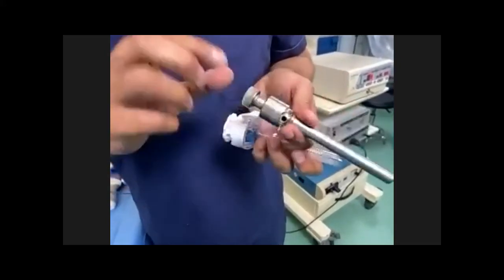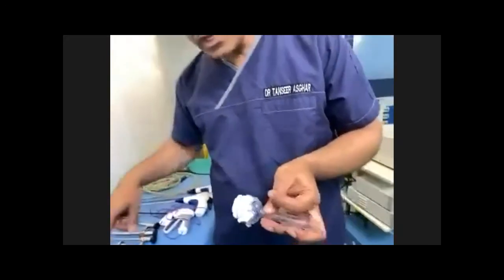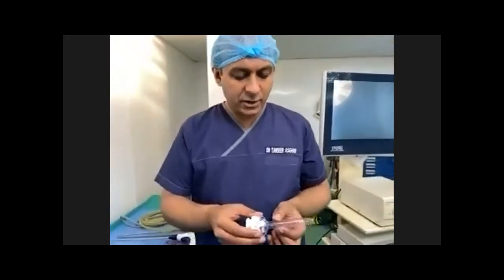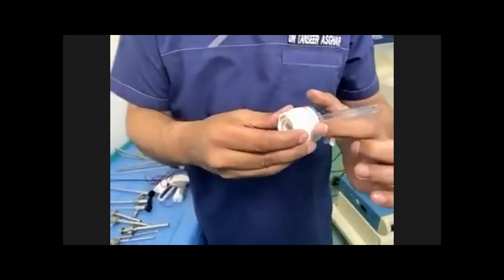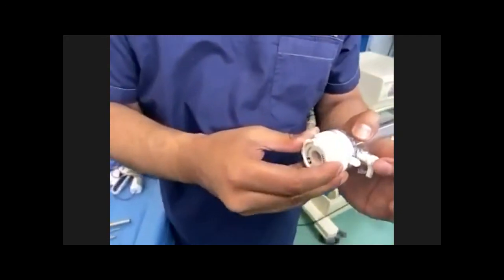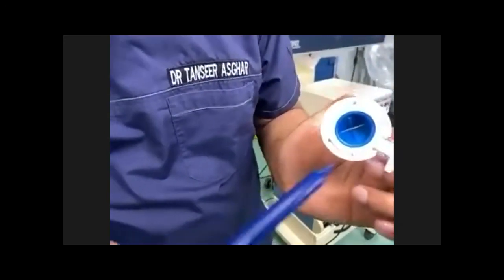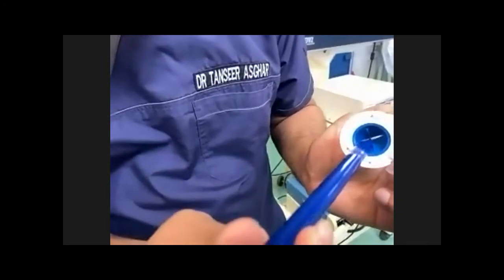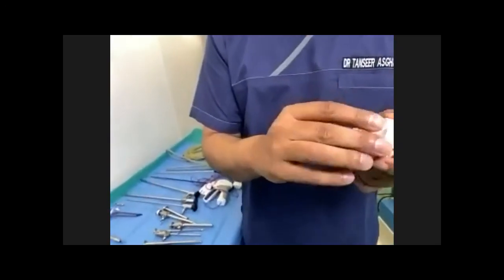So you have to be careful, and you have to hold this trocar static otherwise. So this trocar also has a shaft, and there is a valve as well to control the gas, which is attached over here. And there are different types of mechanisms in this cannula. There's a mechanism of pushing down the button and rotating it to open it up. And here you can see a valve. Again, a valve is here, which stops the carbon dioxide from coming out from here. And here you can see another safety valve from which you can go in.